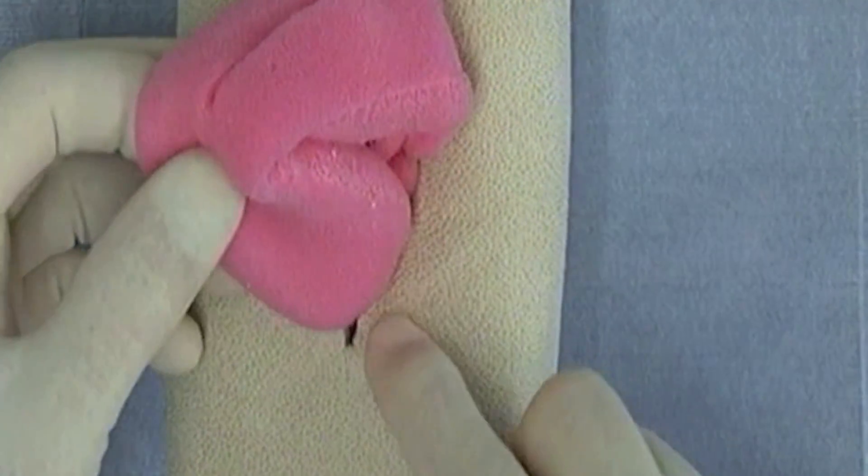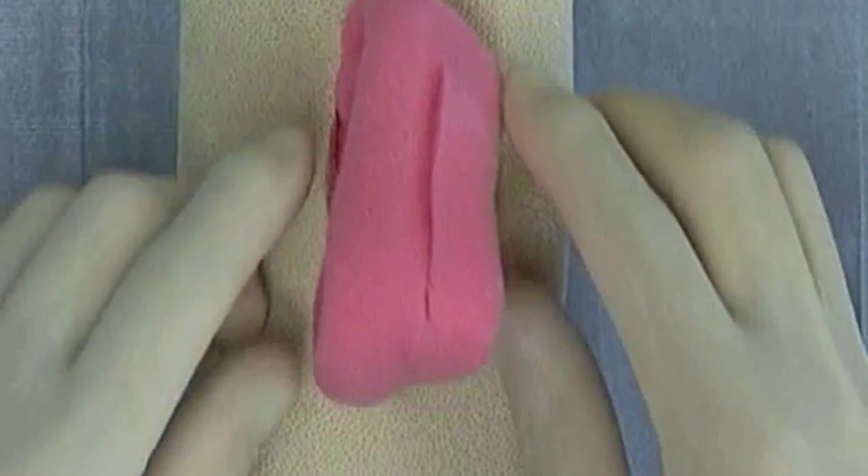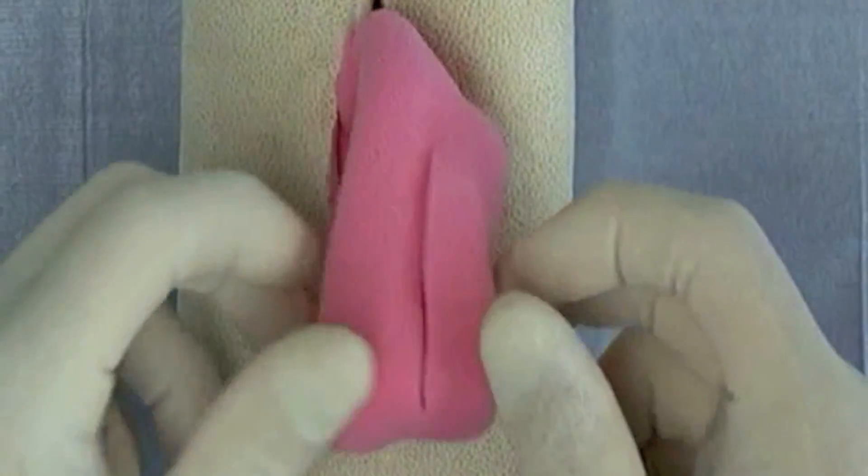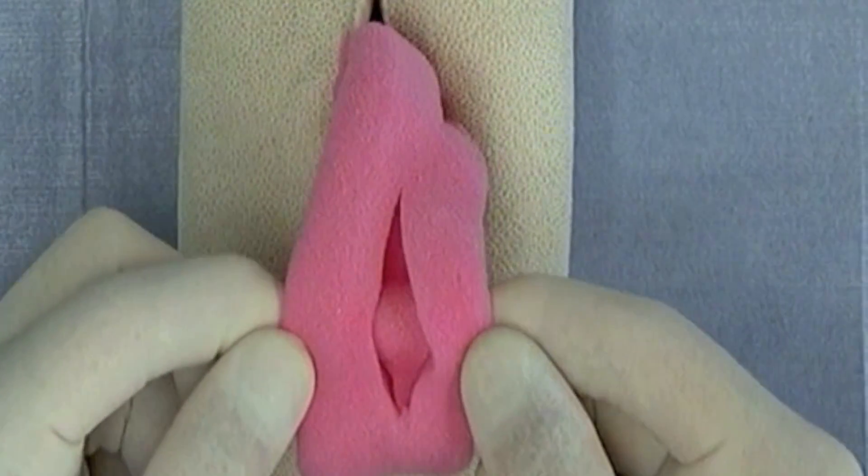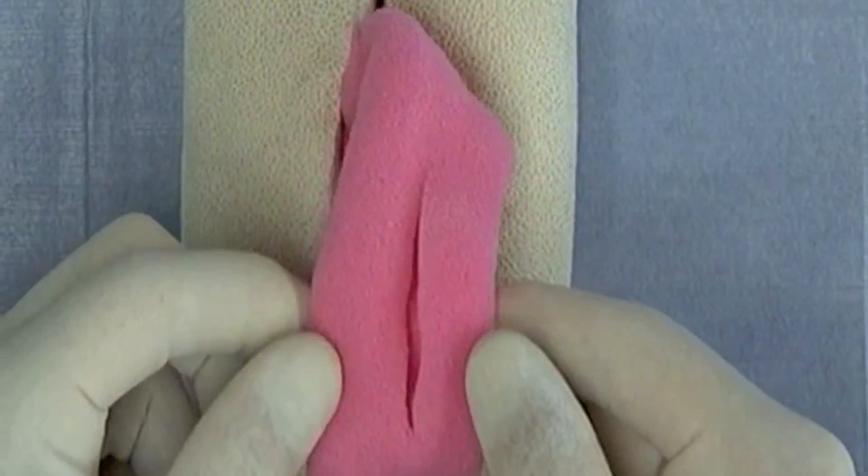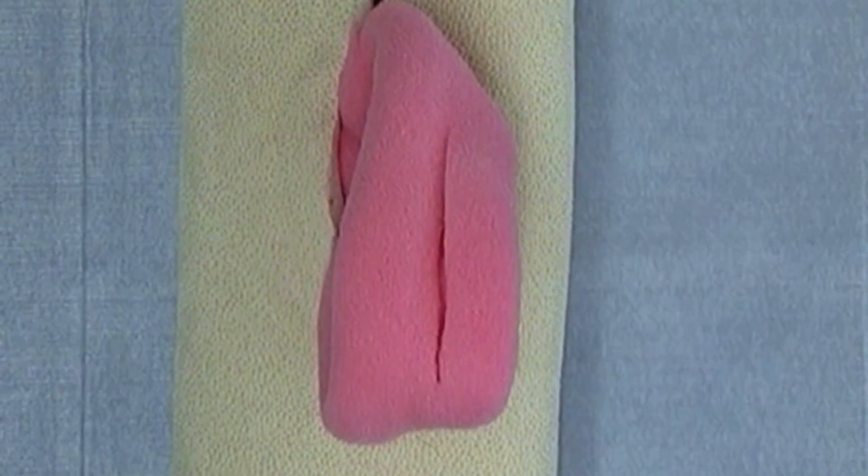While you could practice all of those suture patterns on the skin portion of the daisy, the problem is that you're not going to be able to invert them like you will on the intestinal portion of the daisy. So I would urge you to use that for the suture patterns designed for viscera.